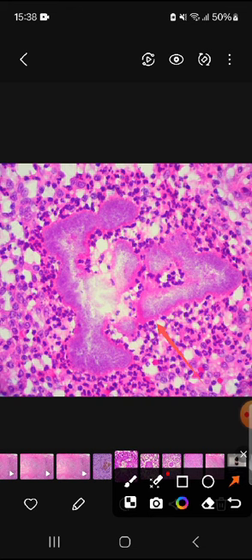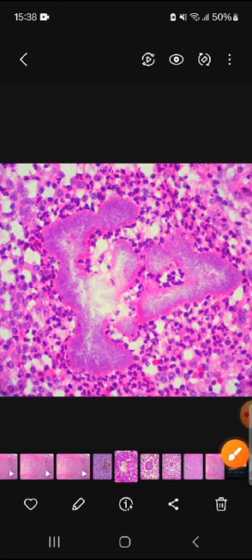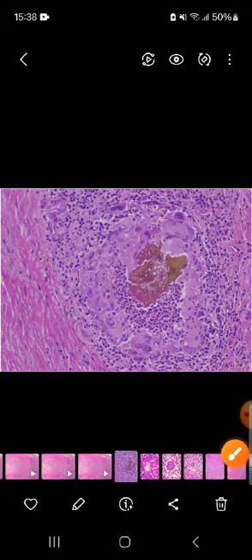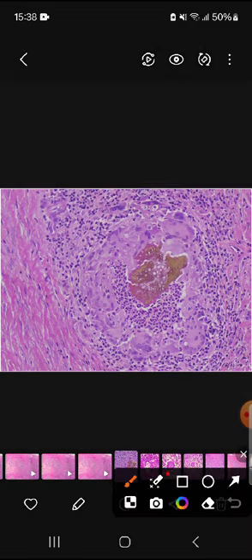This eosinophilic material forms around organisms such as fungi, bacteria, or parasites. Both actinomycetoma and eumycetoma can be stained by H&E, but there is a difference in the size of the filaments — eumycetoma filaments are broader and club-shaped, while those of actinomycetoma are narrower.